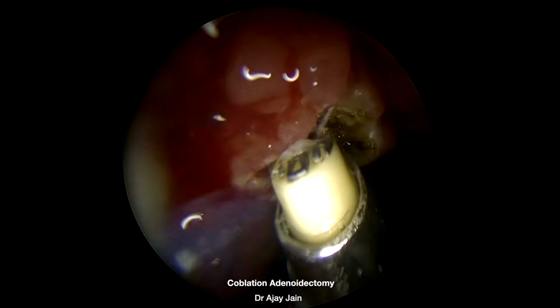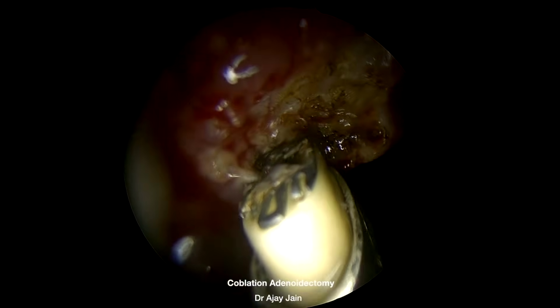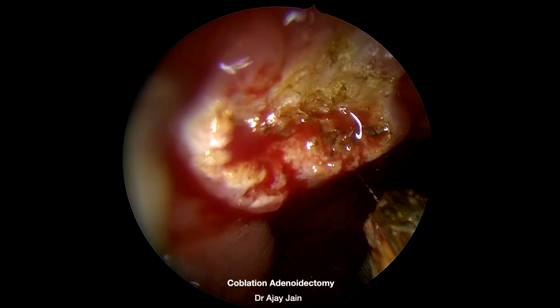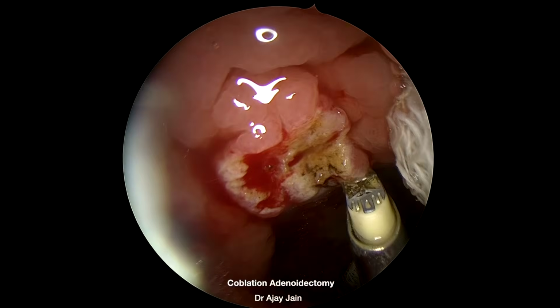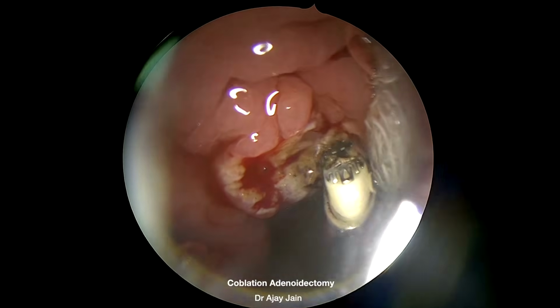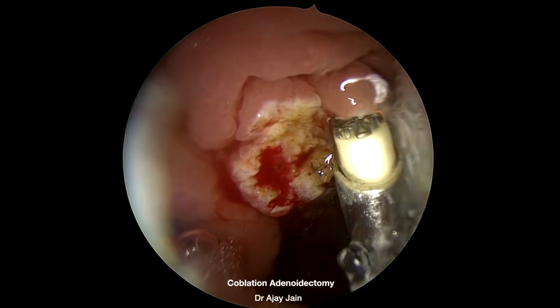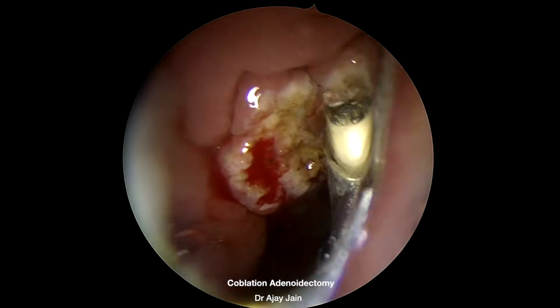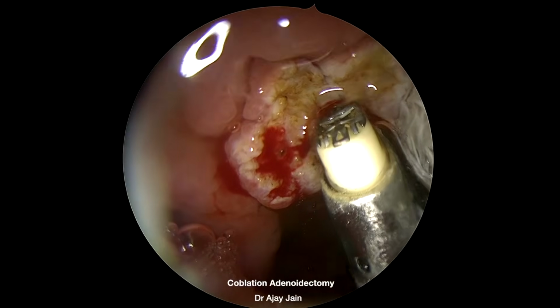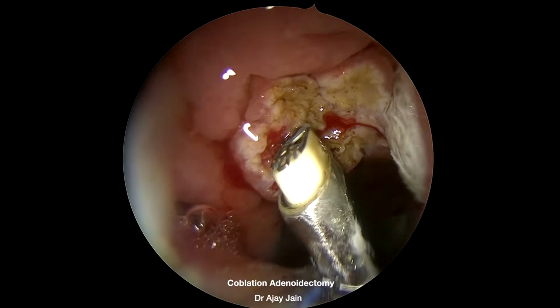I am using the Precise Max Coblator wand with a setting of 9 for ablation and 4 for coagulation or cautery. I always begin from a single point rather than attacking multiple areas simultaneously. This minimizes the bleeding and allows excellent visualization throughout the procedure. One of the major advantages of the Precise Max wand is its sharp tip and large suction channel, which provide efficient tissue removal and excellent visibility.